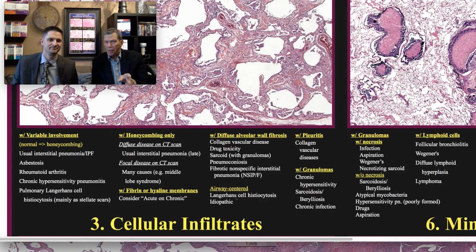So I guess my question would be, if I get to this place, isn't it totally reasonable for me to diagnose UIP? Well, you've certainly landed at what old school pathology mantra would say is a UIP diagnosis. We've got marked fibrosis, architectural distortion, and areas of perfectly normal appearing lungs. So we've got that geographic heterogeneity that everybody thinks about for a UIP diagnosis. The patchwork fibrosis.